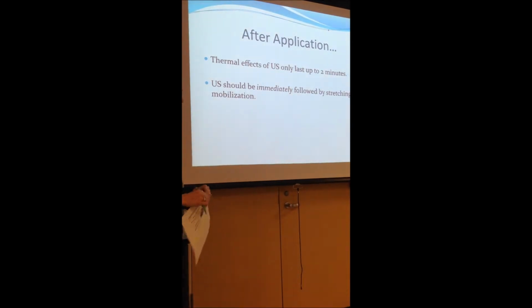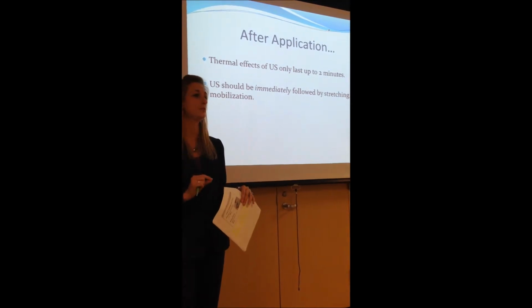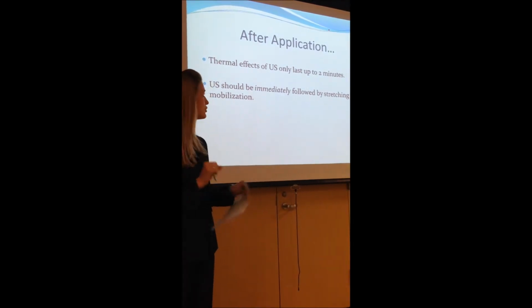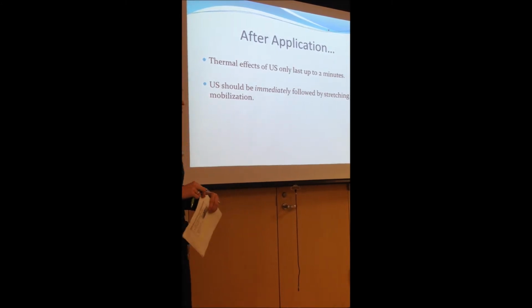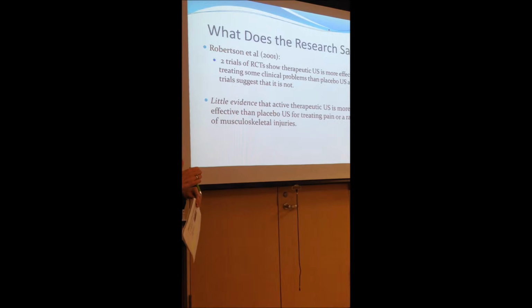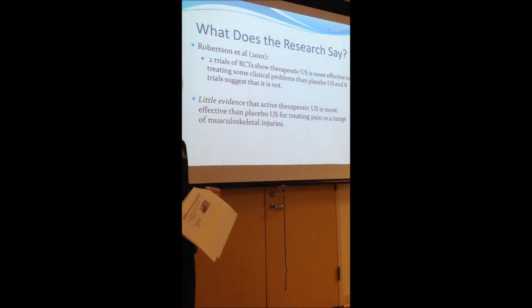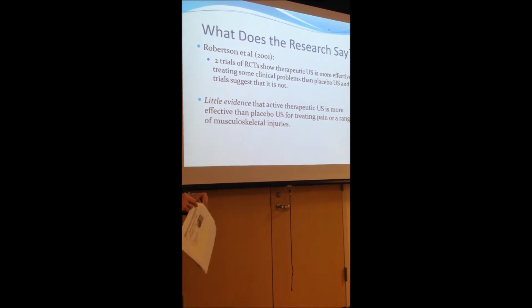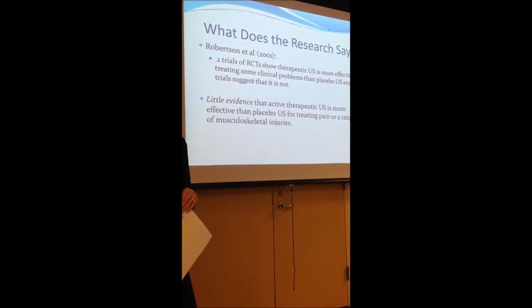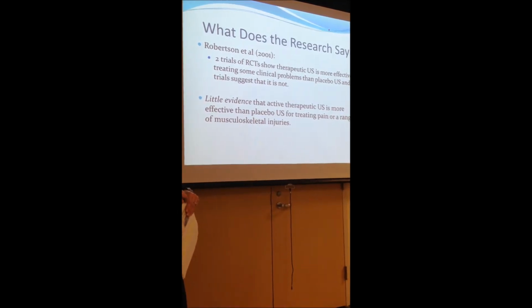After application, like I just said, these thermal effects only last for about 2 minutes. So you want to make the most of those 2 minutes. You want to stretch, mobilize, and get some extensibility out of that tight tissue. So what does the research say? It is very conflicting. Some studies say it works, some studies say it doesn't work. So that is just something to keep in mind when we are prescribing ultrasound or doing ultrasound on people.